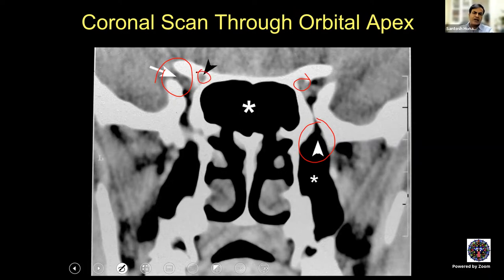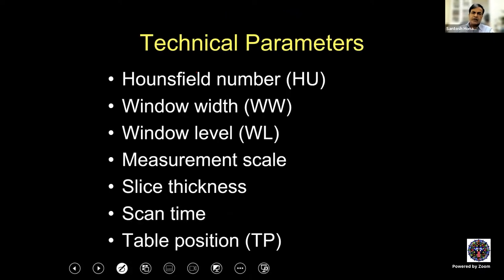As we go more posteriorly, you see all the extraocular muscles crowded up, a large maxillary sinus, and here you see both the superior orbital fissure as well as the inferior orbital fissure, and a well-rounded nice optic canal. The difference in caliber of the optic canal — a 1 to 2 mm difference between the two sides, or obliteration of the optic canal itself — can tell you about the status of the optic nerve.